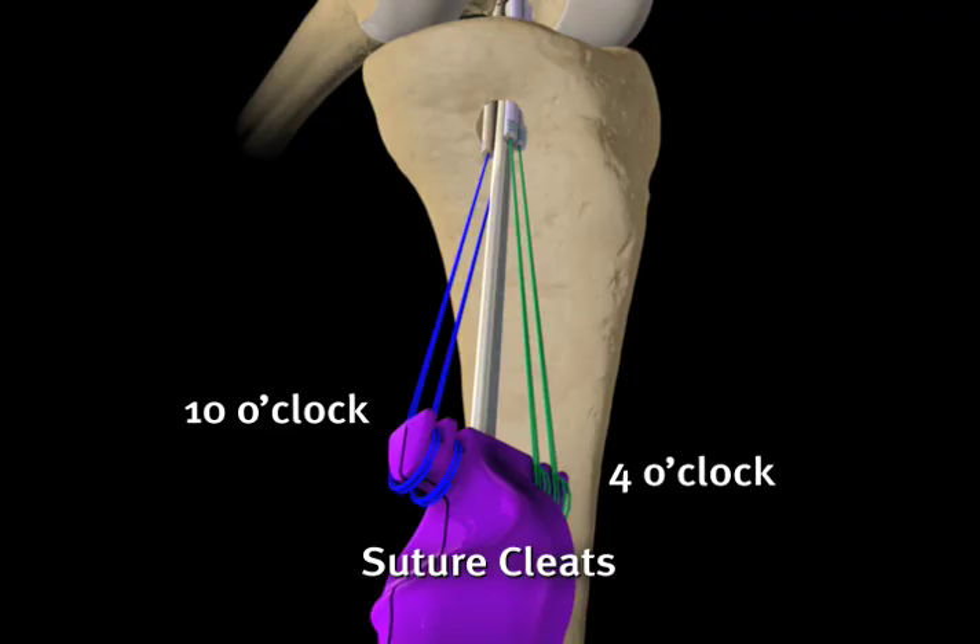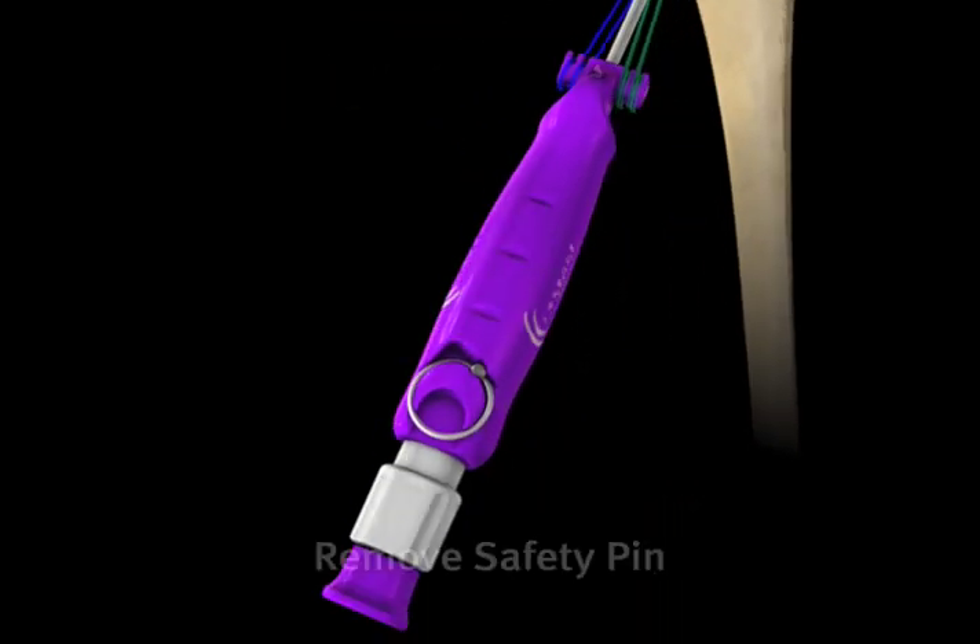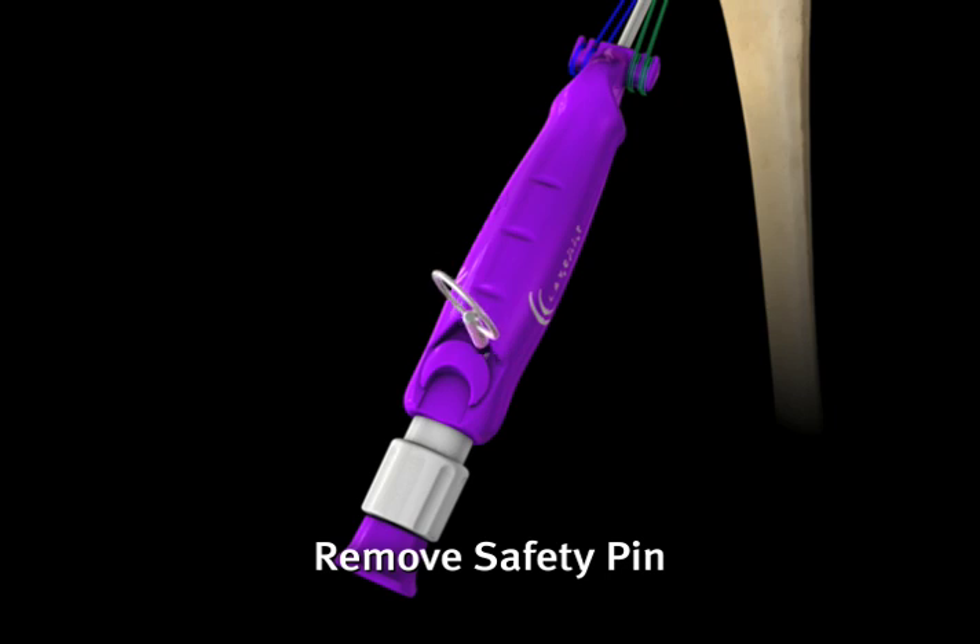Suture cleats should be in the 10 o'clock and 4 o'clock orientation in a left knee. Once the implant is positioned correctly, the safety pin is removed.